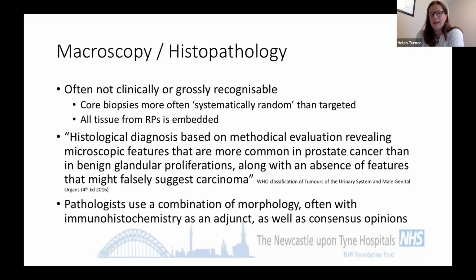Okay, again, I don't want to dwell too much on the ins and outs of actual histopathology, because I'm the pathologist. I don't want to teach you to do that, otherwise I'll be out of a job. But I just did want to mention that when we get needle core biopsies from prostates, we examine them all. We examine all the tissue that's submitted, and we also examine it at several different levels of tissue, and that's because of the nature of prostate sampling.